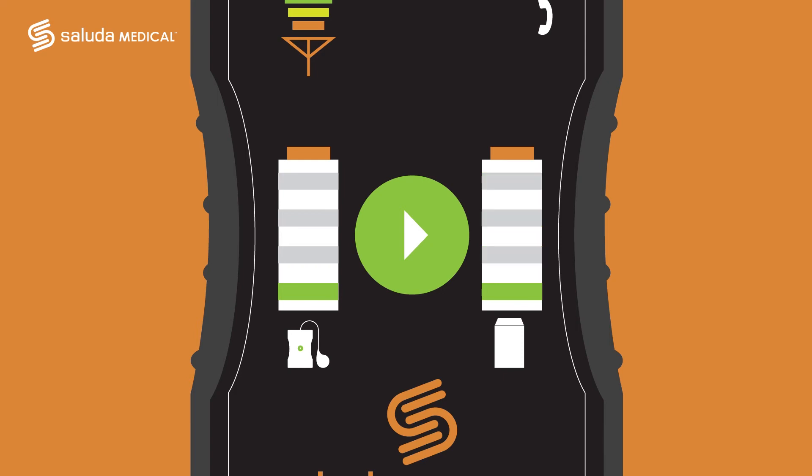When the CLS indicator shows one bar, you should recharge your device as soon as it is practical. If you do not charge your stimulator, it will eventually stop delivering therapy.